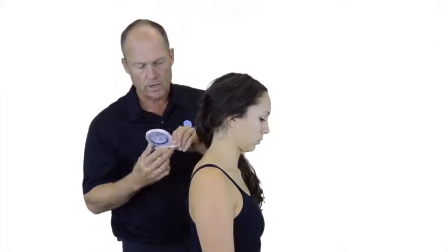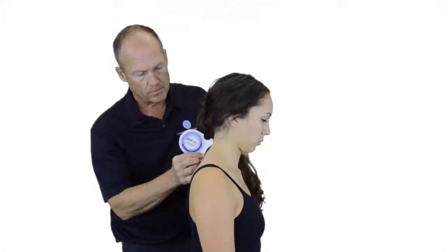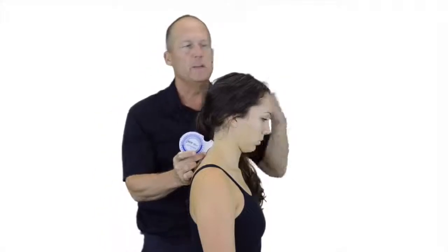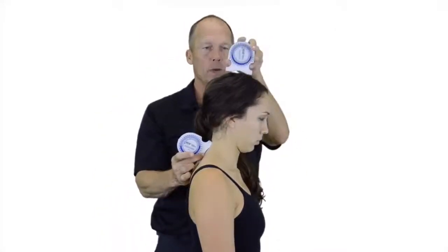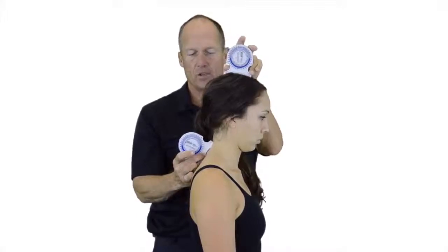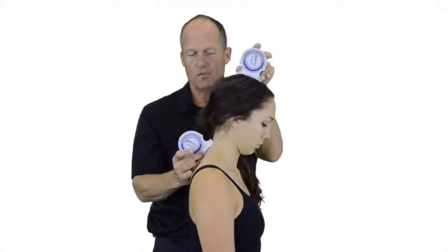We'll zero out our inclinometer and directly place it over T1. Our other inclinometer will be zeroed out as well, but placed directly over the top of the cranium.